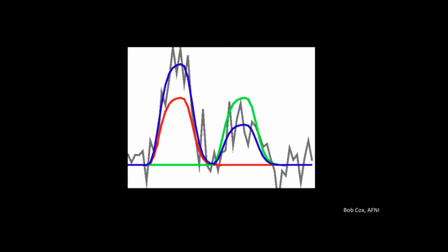I'm just repeating this a lot because this was something that for some reason I got really tripped up on early on. One of the first times I asked somebody what a beta weight was, he said, "That's really complicated." I was like, damn, that's got to be really complicated if this guy doesn't know about it. So, this is also something I struggled with a lot when I started. So you get one beta weight per voxel. Yes. That's it. Per regressor, sorry.